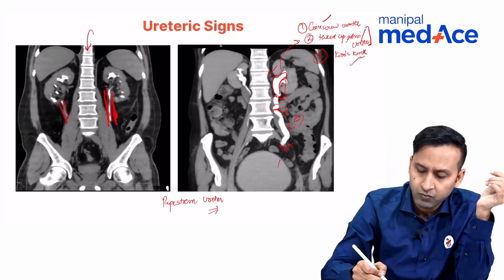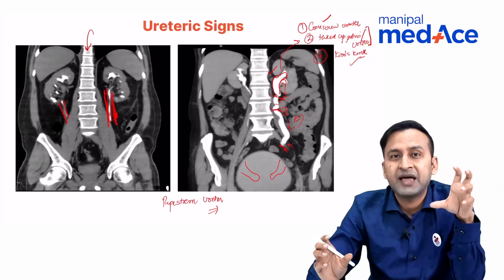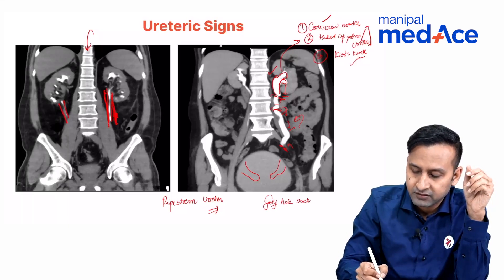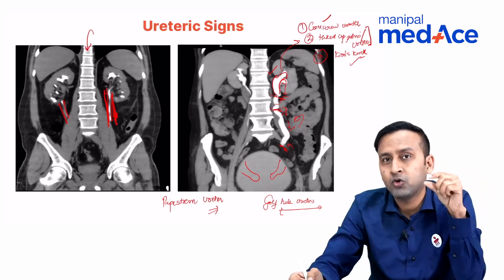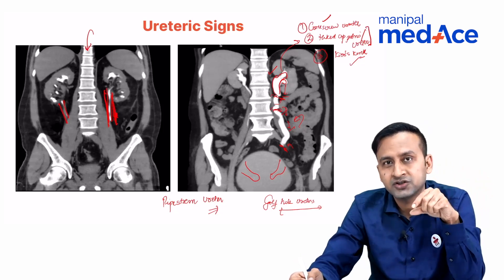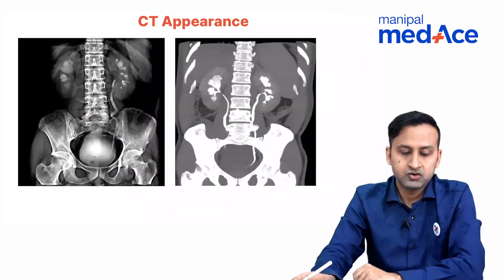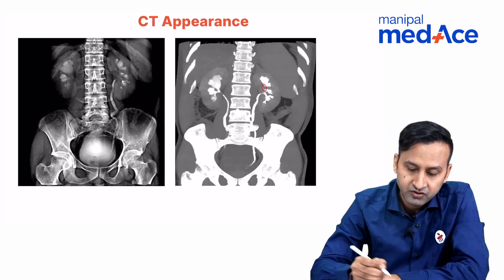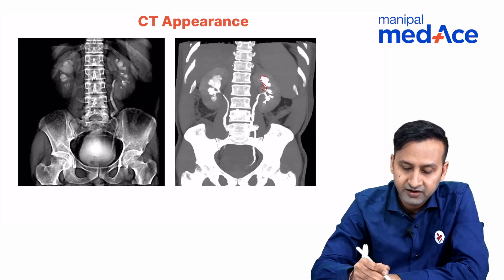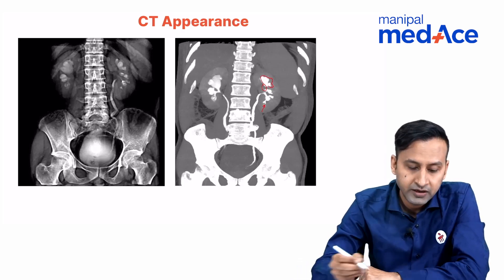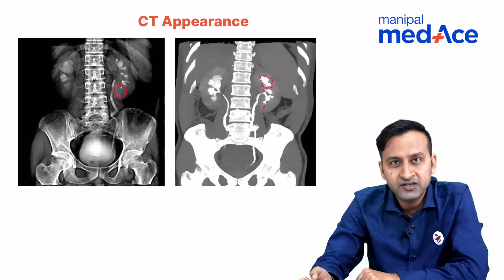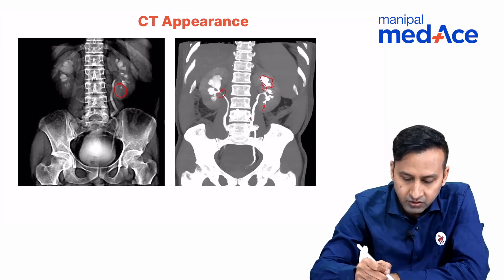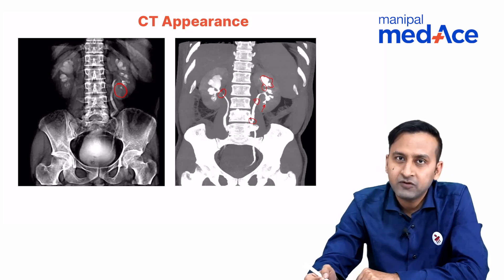Once the ureters open into the urinary bladder, their openings also become abnormal — widened and gaping. This is called golf-hole ureters, representing abnormal openings at the ureterovesical junctions. On CT IVP, you can classically see all the findings: narrowing of the infundibulum, calyceal dilatation, fibrosis at the renal pelvis, and ureteric narrowings. The moth-eaten appearance is not well seen on CT, which is why IVP is the investigation of choice in early stages.